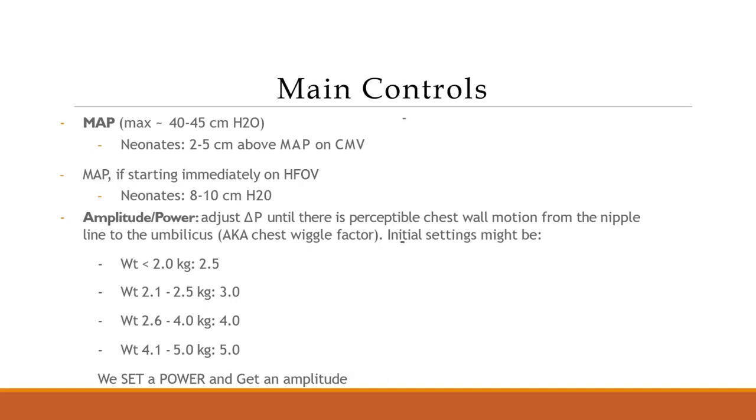We can do a gas, we can check the TCOM, make sure it's so. But we're not going to try to keep going up and down to get that set amplitude. We're going to let the amplitude drift based on the power. Now, the same thing if you had that 25 on that 3, and then suddenly it's only 21, that means troubleshooting is needed.